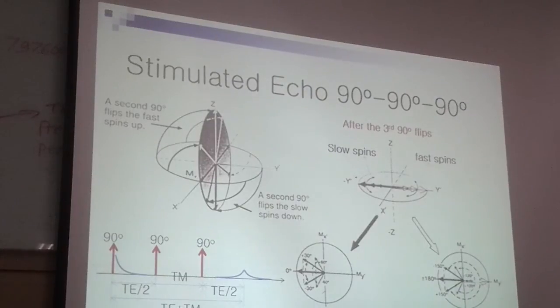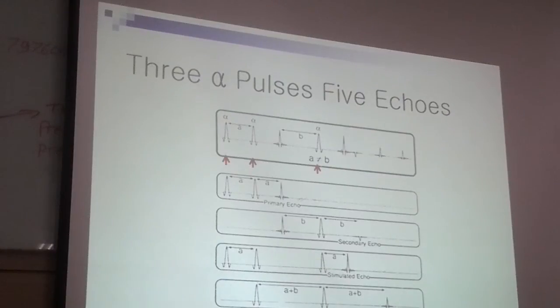This time definition is somewhat different from the echo time of a spin echo sequence. This sequence is usually used for the localization of a spectroscopic technique.